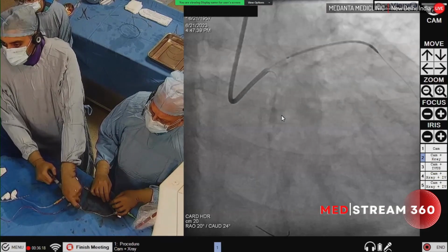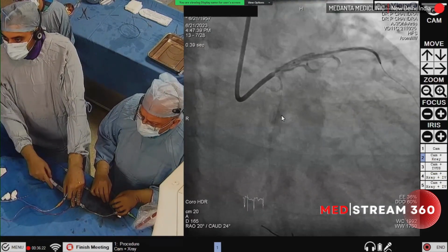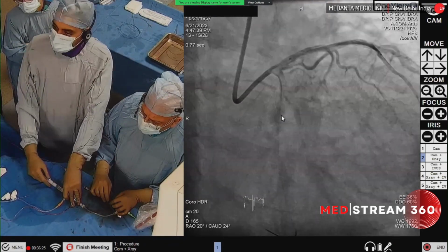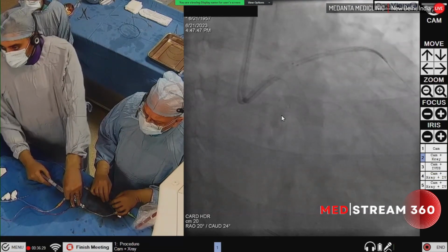Check again. Yeah, maybe a little bit. No, it's fine. It's fine. Just adjust distally. Okay. Check please.